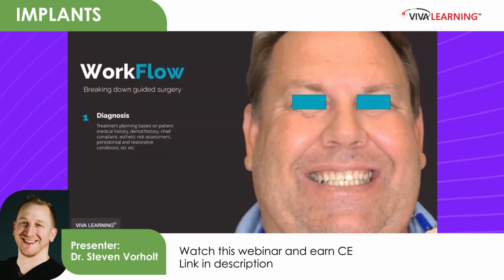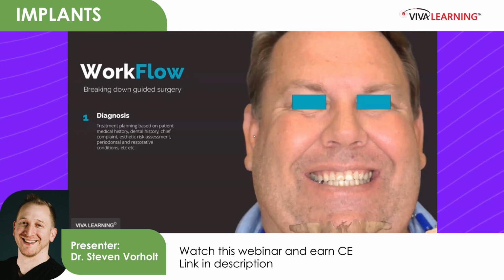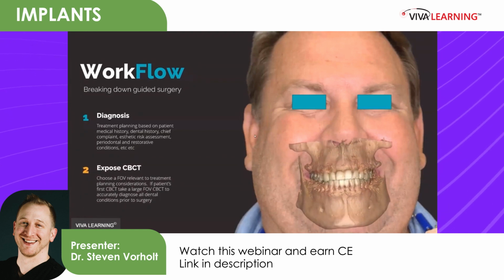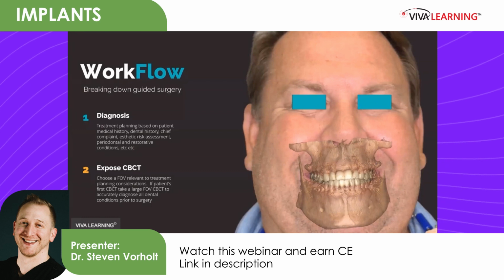First thing we're going to do is diagnose the case. Of course, we're going to do treatment planning based on a whole host of factors. And then we're going to take a CBCT. Okay, choose your field of view that's relevant to the treatment considerations.